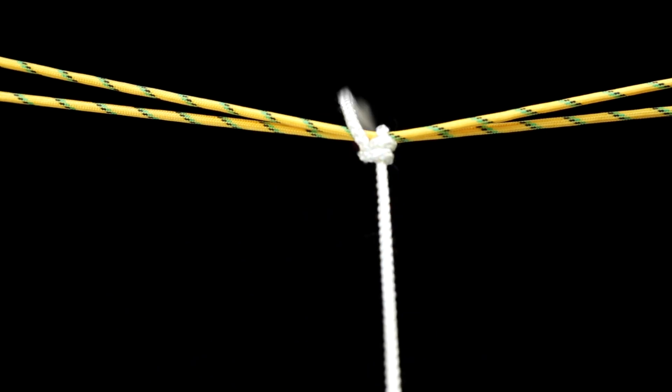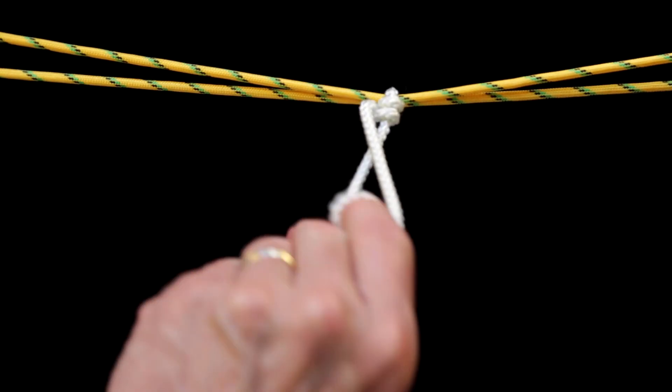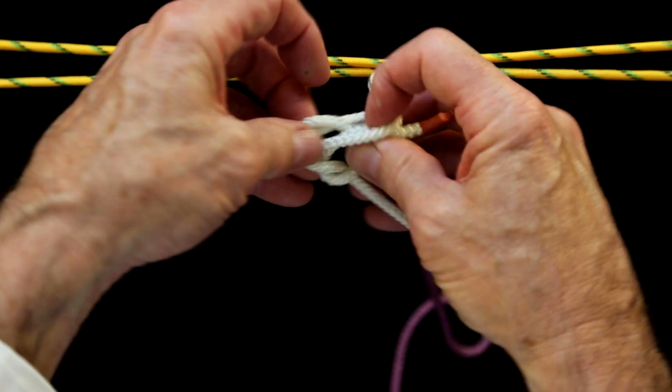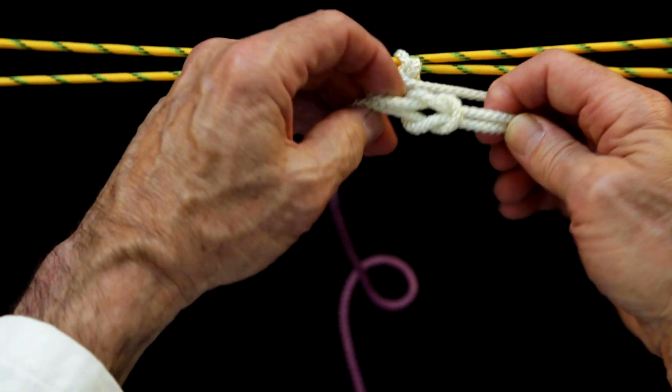For insurance, throw another loop in the opposite direction and tighten that. What does the third loop create? If you rearrange the last two loops, you find a classic locking square knot.